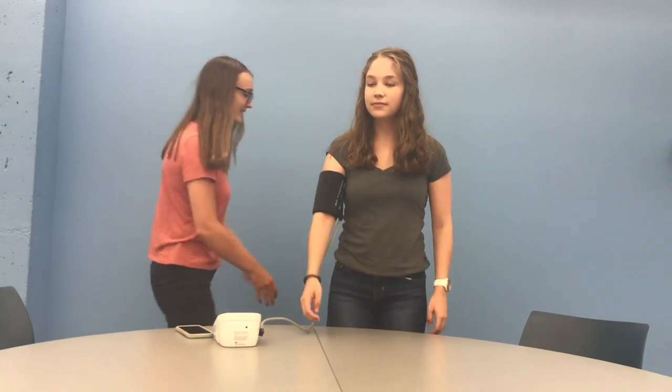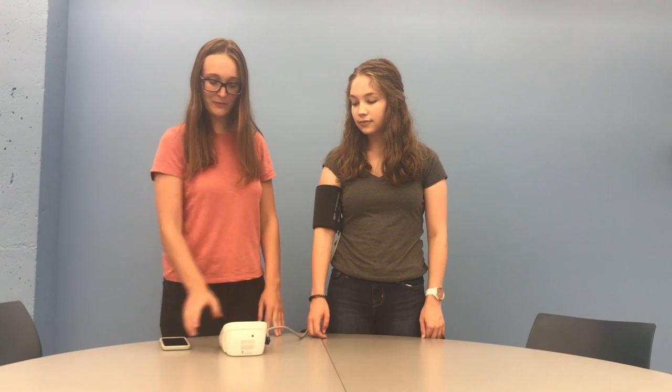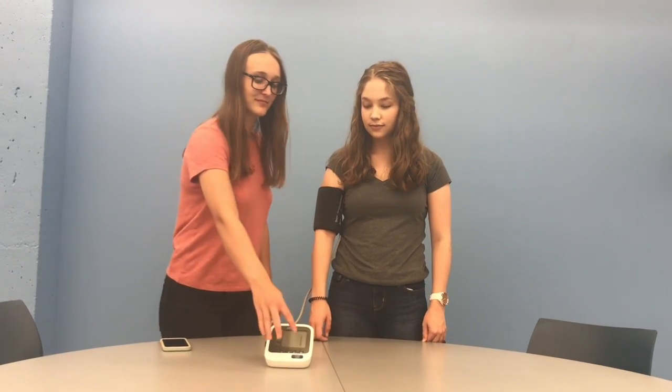Ask the participant to stand. Once the participant is standing with their arm resting comfortably down by their side, set a timer for 1 minute. Once the 1 minute is up, take the blood pressure.